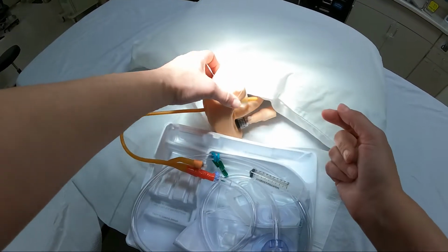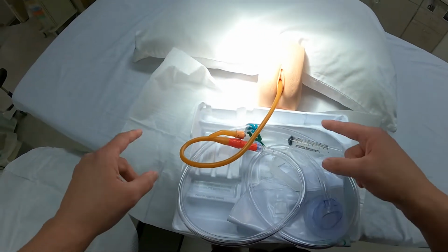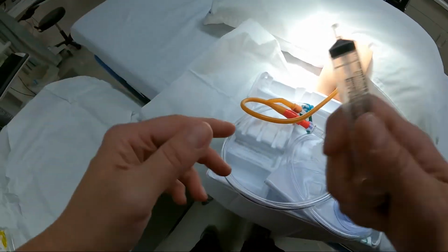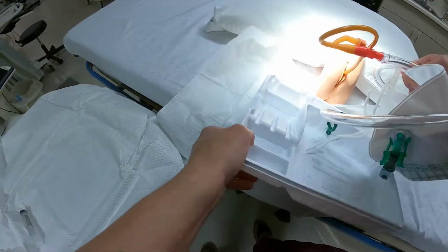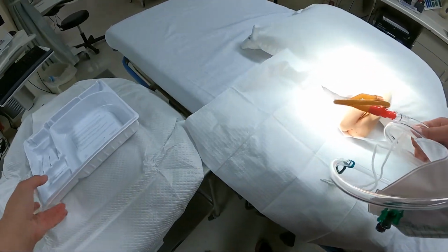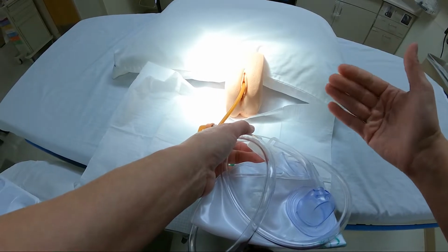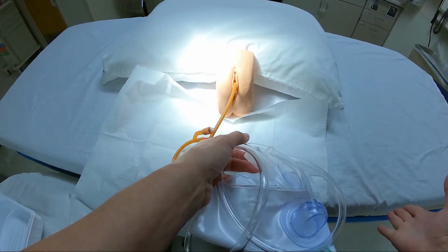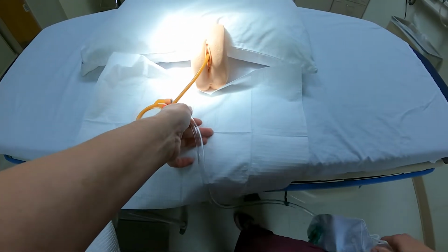Of course, you can't really do that with a real patient. I get that. Now, after you're done, get new gloves and wash your hands. We're going to take this right here, because you don't want the catheter bag and the catheter sitting up on the bed. You don't want the urine sitting there growing crap and then getting shoved back up into the bladder.